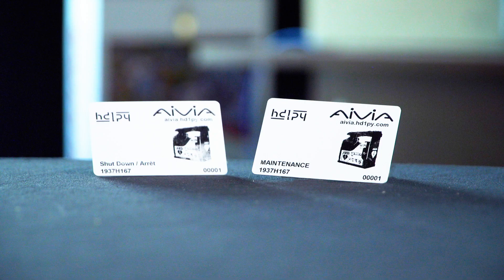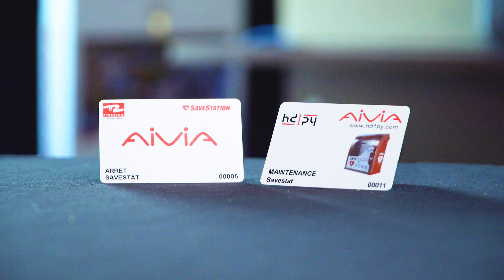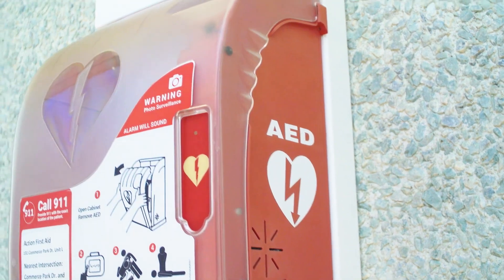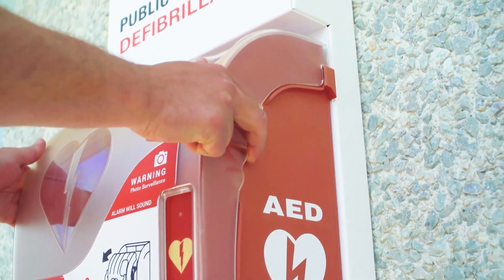As described in the maintenance card instructional video, tap the maintenance card over the A in AED on the right side of the cabinet to deactivate the cabinet's alarm.